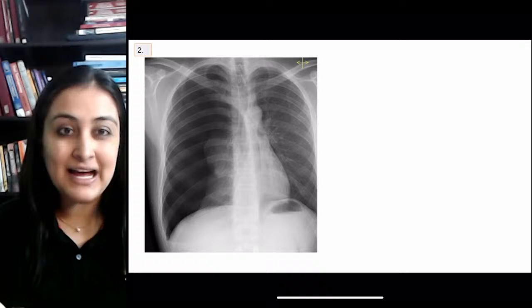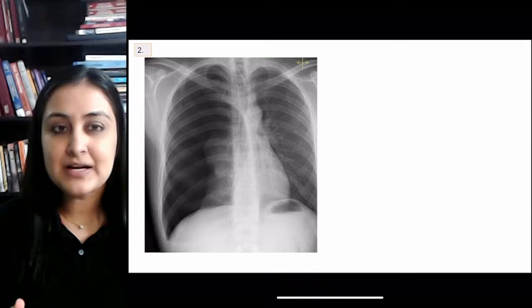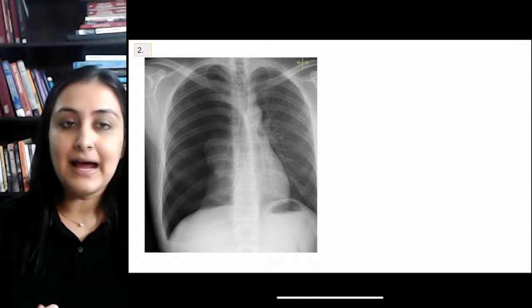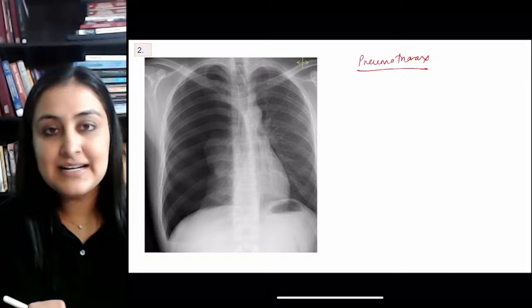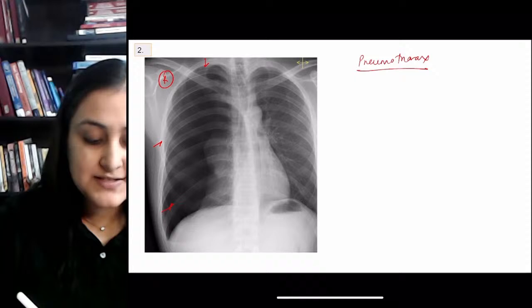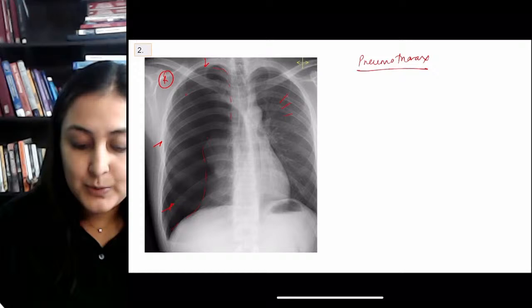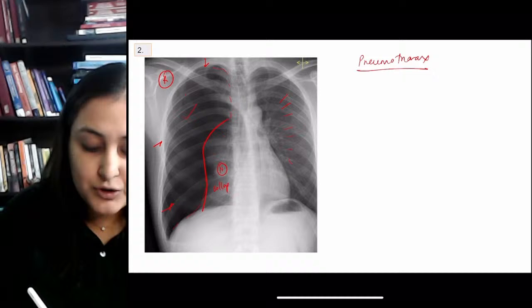Image 2: History of trauma, chest pain, and a chest X-ray is done — this is pneumothorax. For diagnosis: identify which side is involved. On the right side, there is increased blackness and increased lucency. The key is there are NO lung markings — just pure black air. Normal lung has markings. You also see a line demarcating it from the normal underlying or collapsed lung — this line is the visceral pleura, the visceral pleural line.